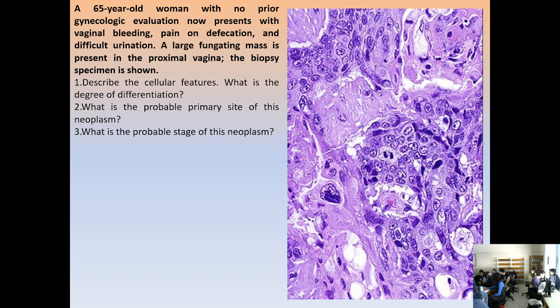Large nucleus having an irregular size. This is morphology. All right, we saw large nuclei, we saw that. Yes. Technique? No technique. For the nature, for histogenesis, what does it say? Let me see.